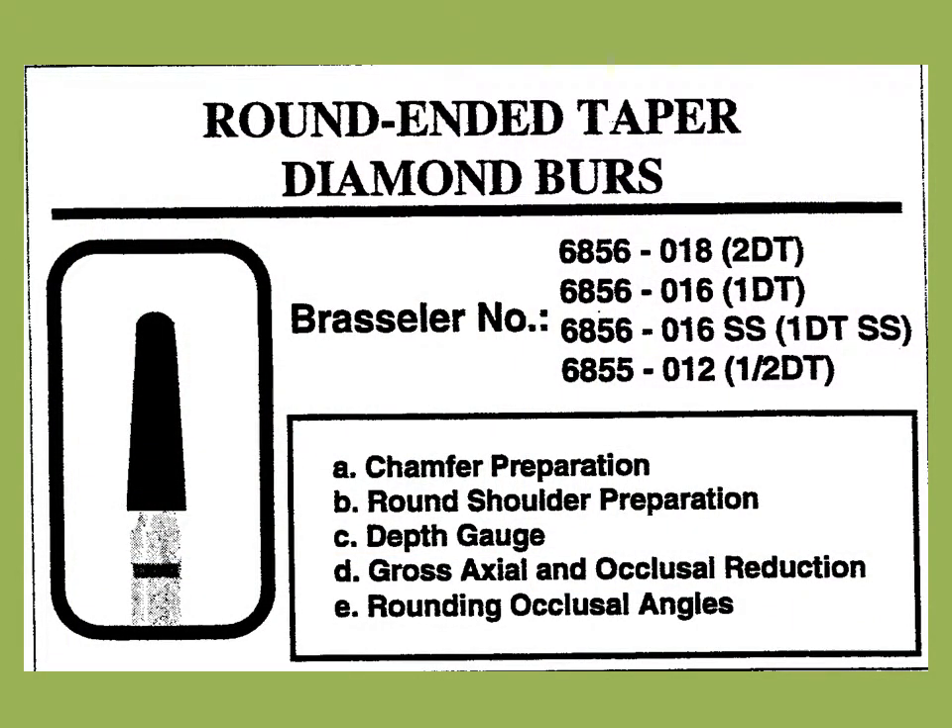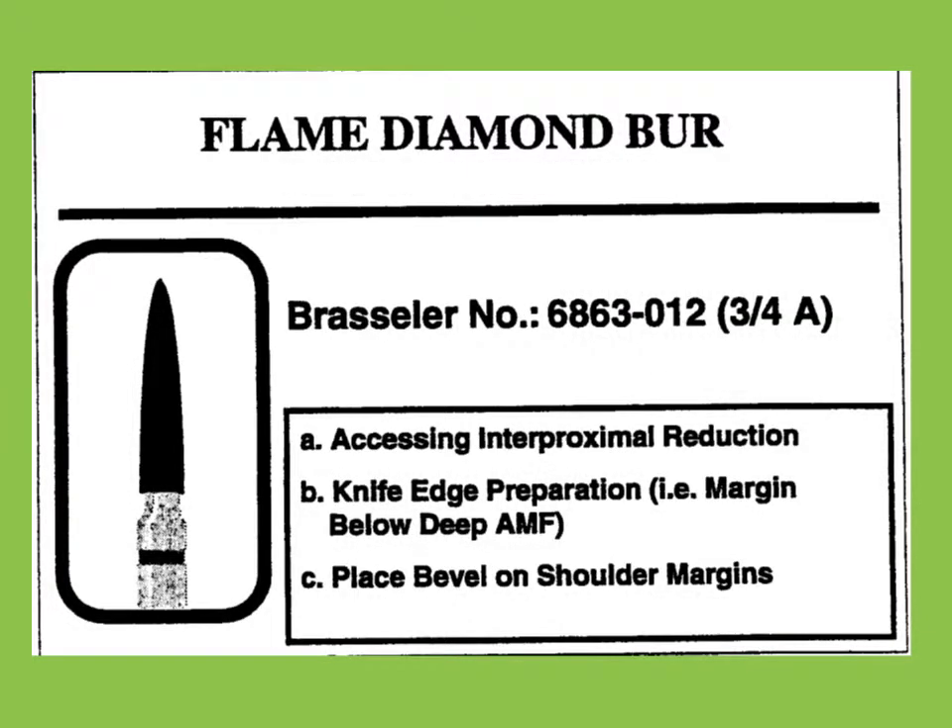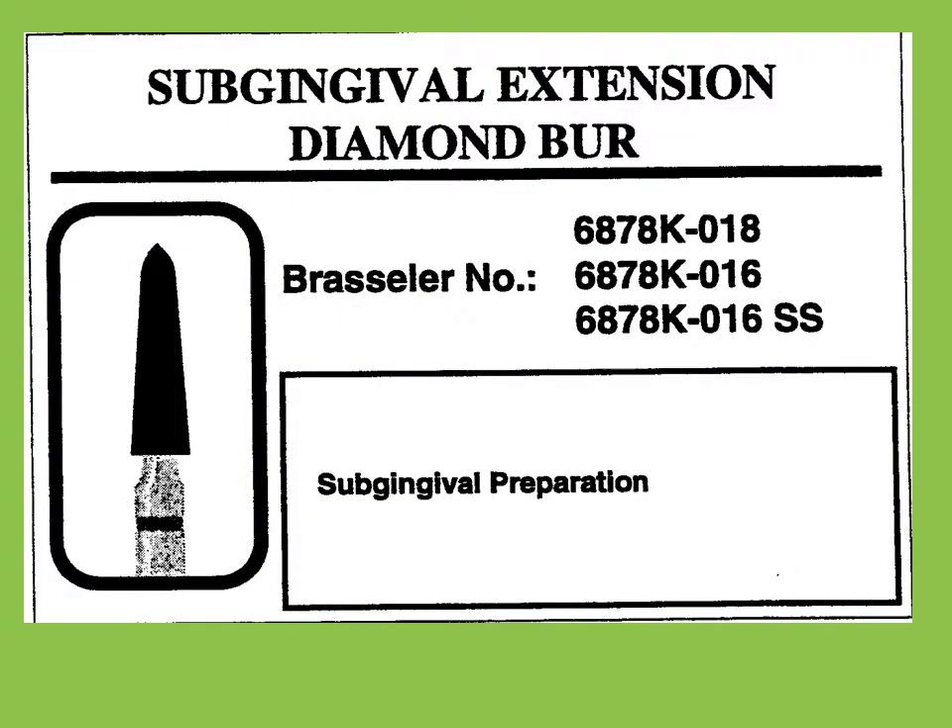The preparation has a chamfer margin prepared with the round-ended tapered diamond burr such as the Brasseler 6856 type burr. Correct application of this burr will result in a chamfer width of approximately 1.5 mm with axial wall taper of 3 to 5 degrees of each axial wall. Gross reduction is also performed with this type burr. The flame-shaped burr is used to provide access to the proximal surfaces of the tooth. After appropriate access is accomplished, the 6856 is used to refine the proximal chamfer margin. The K-type burr is used to remove lips from the finish line. Lipping of the finish line is produced when more than one half the burr width engages the axial wall in the chamfer area.